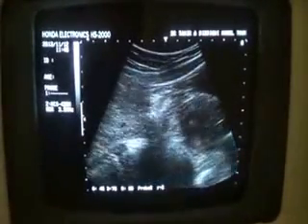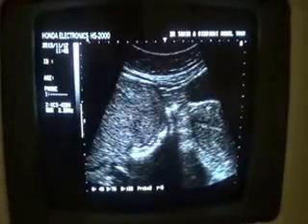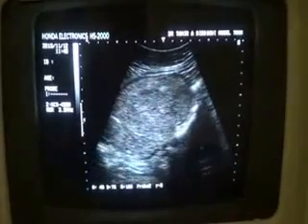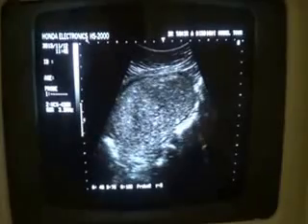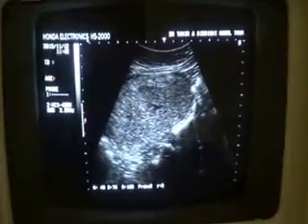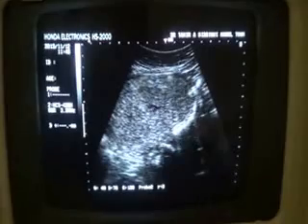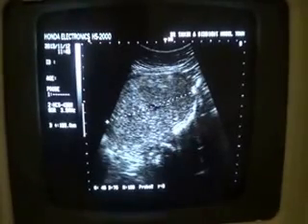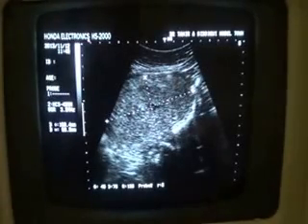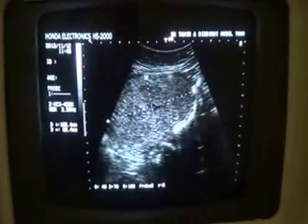Now, in the region of the right adnexa, we see a solid mass. This is the central cystic area. This is the echogenic mass, dense coarse echogenic, measuring approximately 10 by 6 centimeters.